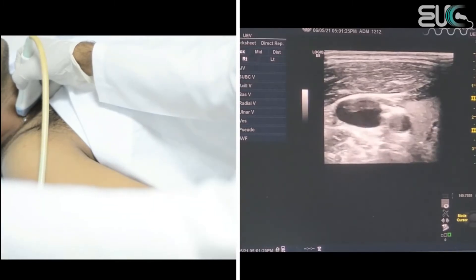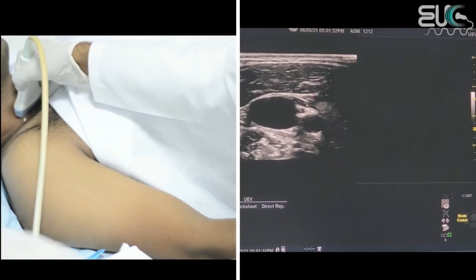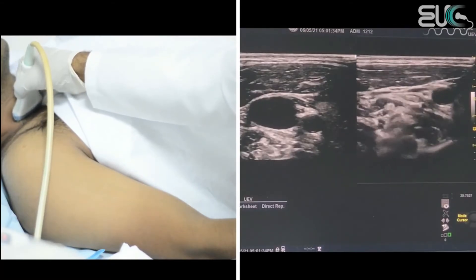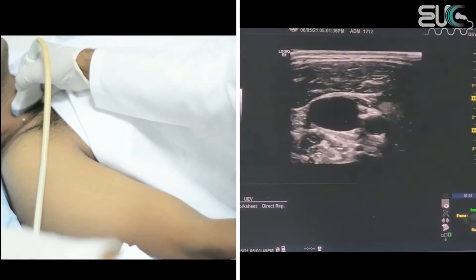I will adjust the image and reduce the gain. I will check the compressibility of the right internal jugular vein, and when I compress, it is totally compressible. We have here the right internal jugular vein, and here we have the right common carotid artery.